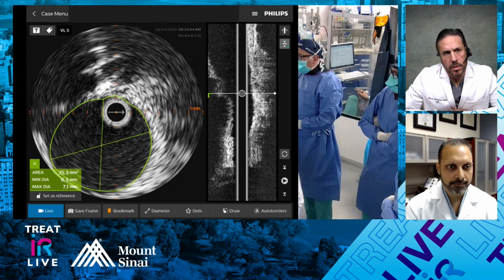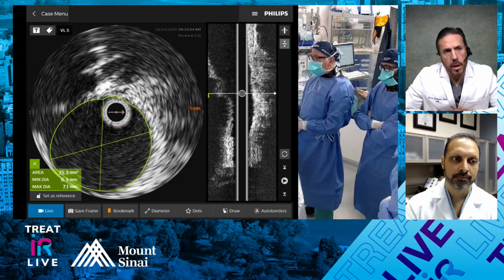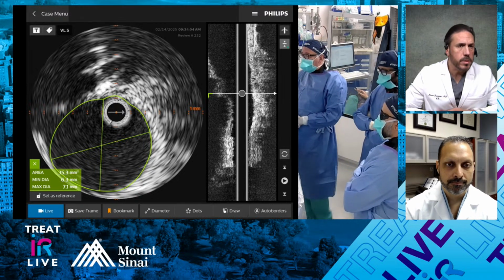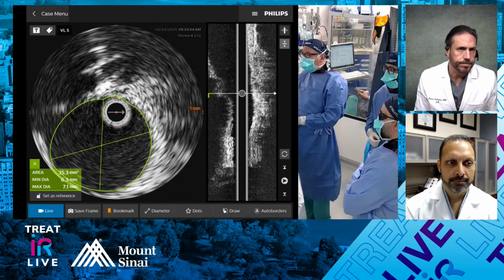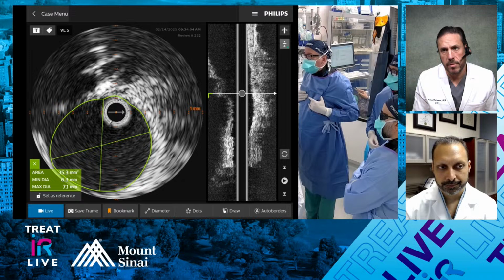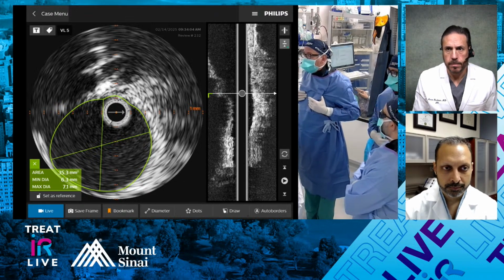You've already placed a drug-eluting stent, so the decision to put somebody on an antiplatelet agent, even though I think he's already on Plavix, right, Rob? Yes. So I'd be fine with either. I probably would lean towards the larger stent and not post-dilate it much bigger than 7. That's sort of my bias here. What do you think, Parag?